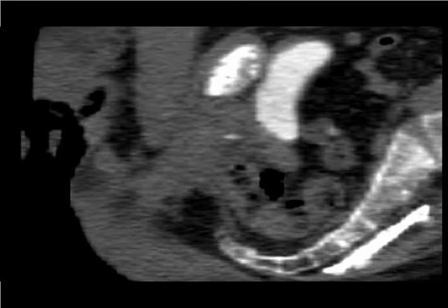This is the bladder here. We have seminal vesicles here. The prostate would be outlined right about there. This is the pubic bone here. If I overlay the PET on this image, you see two strong hotspots here.